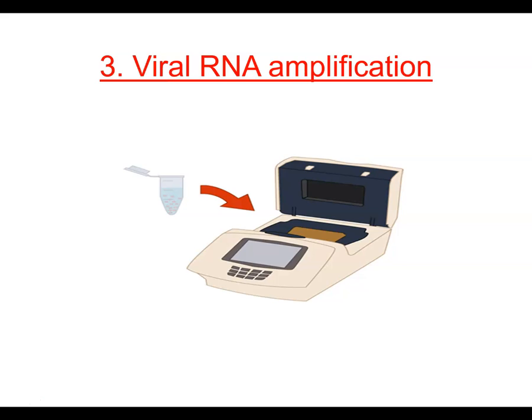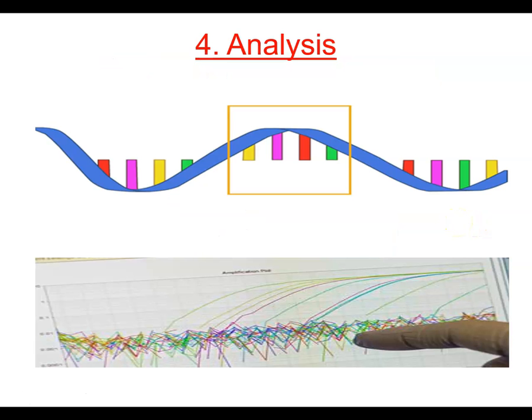After amplification, you can carry out the analysis. If you have the virus genome in your sample, these pieces will be amplified many times, and the machine can detect the different kinds of virus genomes. If you don't have it, then you just have background information. If you have the genome, it will be amplified and give a positive signal.